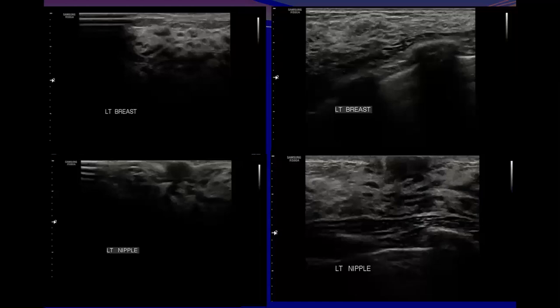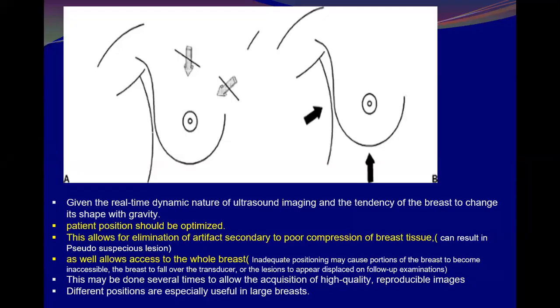And early on in techniques, in the mammography course, we discussed that the breast is fixed on the medial and superior part and mobile on the lateral and inferior part, and we discussed how we could manage this while doing mammography. Today, we want to know what is the impact of this in ultrasound examinations.